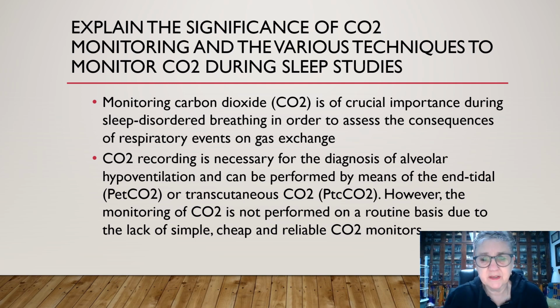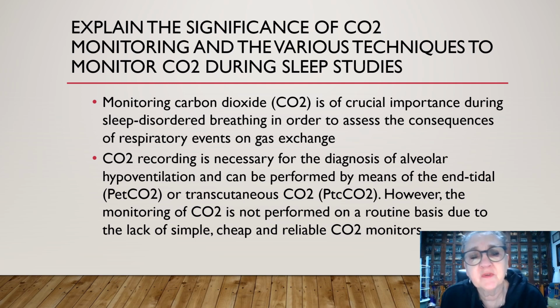CO2 recording is necessary for diagnosis of alveolar hypoventilation and can be performed by means of end-tidal CO2 or transcutaneous CO2. However, the monitoring of CO2 is not usually performed on a routine basis due to a lack of simple, cheap, and reliable CO2 monitors.